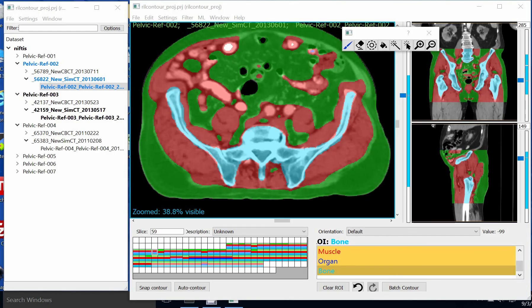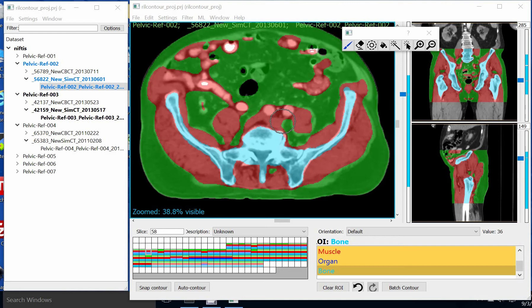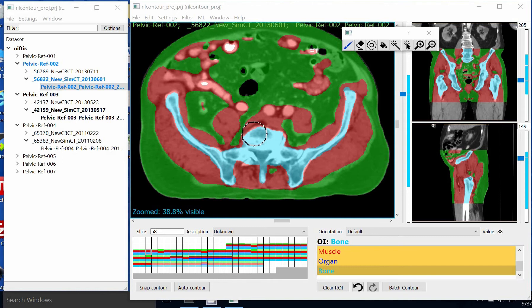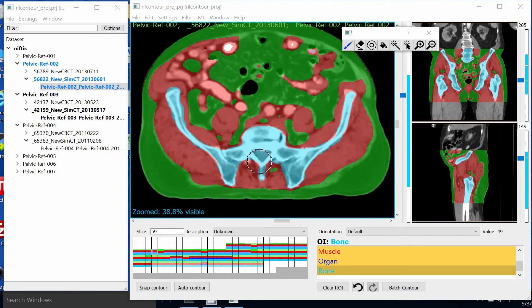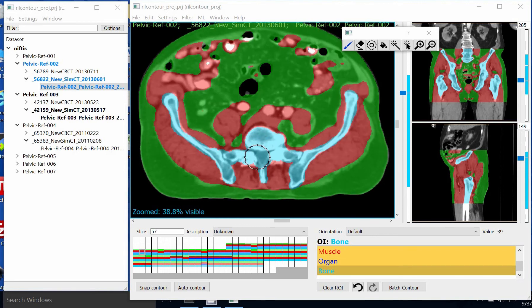So we finished correcting bone on this scan. Bone is a pretty straightforward compartment — the anatomy is pretty easy. First, I locked the fat since fat around the back is pretty much correct, so it was easier to not have to worry about painting over that. Secondly, you may have noticed that I included the spinal cord and the intervertebral discs in the bone compartment. This is a matter of preference, but for this study we're looking at fat and muscle volumes so it's just easier to loop that all into one compartment.